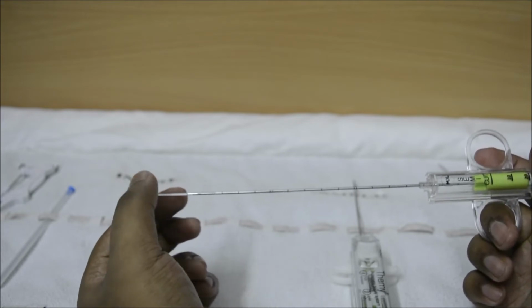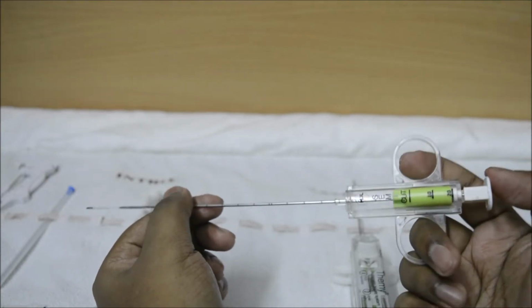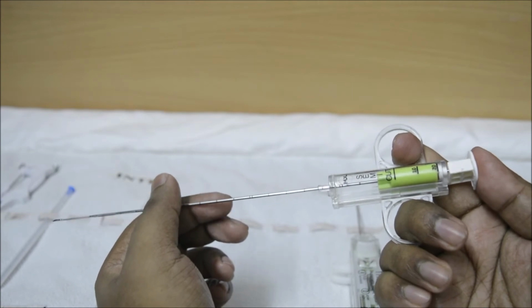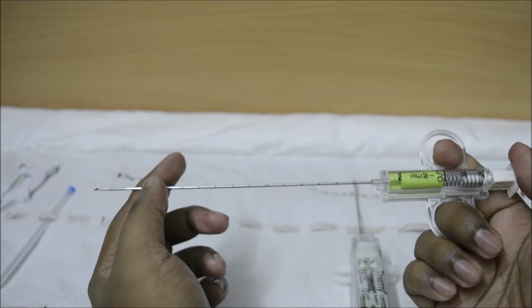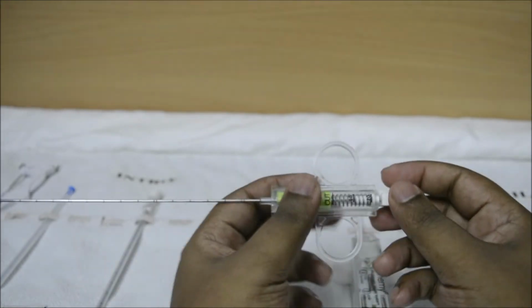So the sample collection tray is now exposed to the tumor tissues. So now it is already collected. How to capture it? Since it is semi-automatic, no manual labor is needed. You just gently push the trigger further. Now focus on the tip as I push. You hear the click sound. You can assume that the tray is now closed. I'll do that again.